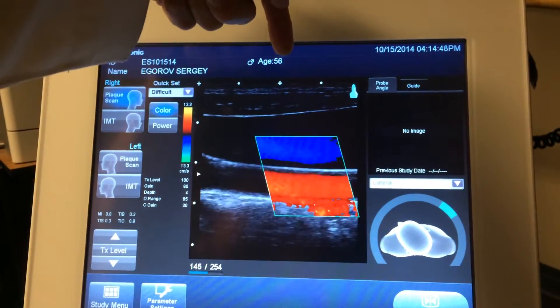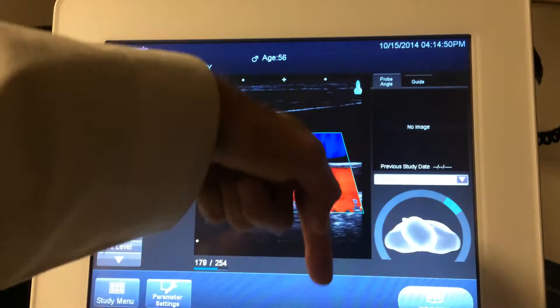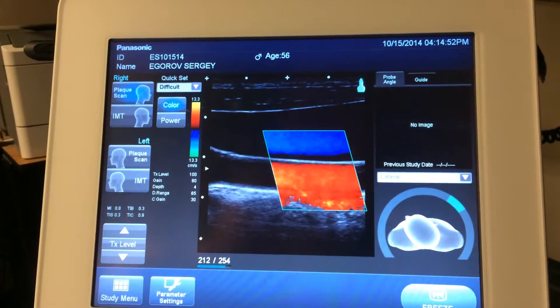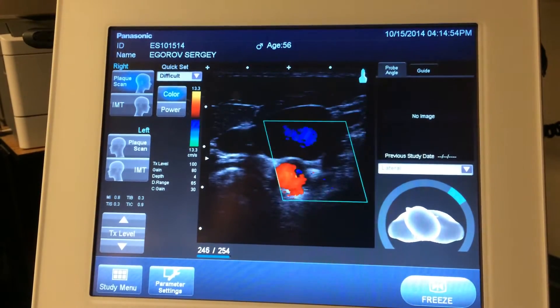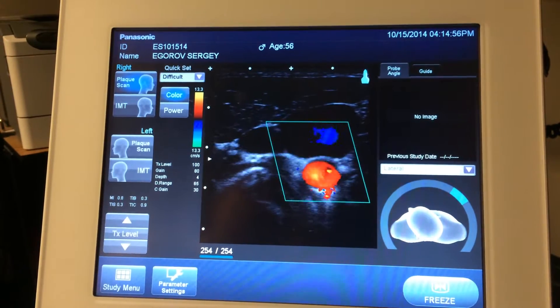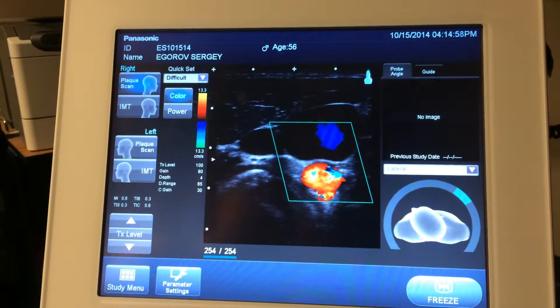The ultrasound signal is coming from the skin through the vein and then the artery. If I turn my transducer this way, this is called the short axis view of the artery and the vein.